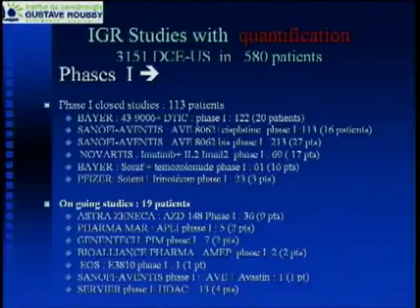But you understand that the companies want to use the functional imaging in order to understand very quickly which is the best drug for the best patient, in order to push the drug in different, very selected tumors, or to stop the development of a drug if we have no answer with the functional imaging.